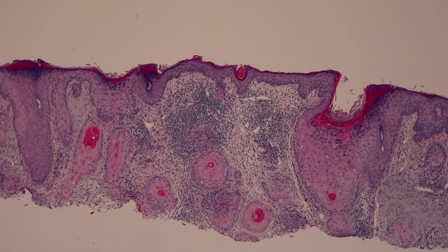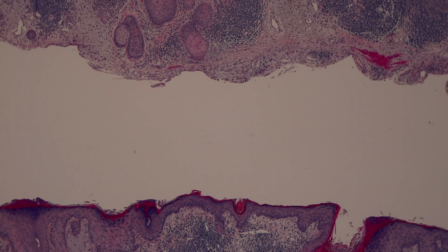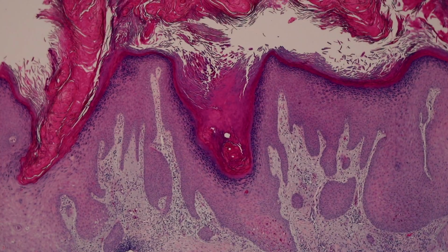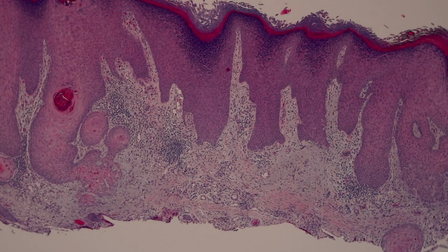So, and here's more of the squamous cell carcinoma here. And again, look, what if we just had a shave through here? It's a fun and scary game to play of what if we just had this in the biopsy. And I think even though it's a little terrifying, it also helps us to learn how to have that index of suspicion, when to worry, and what could go wrong. So trying to artificially create that scenario to help us see, oh, if I only had a biopsy here, there's no way I would know that there was cancer underneath.